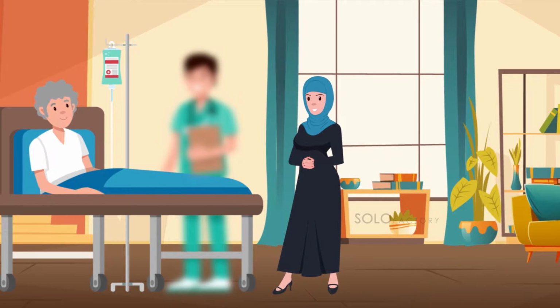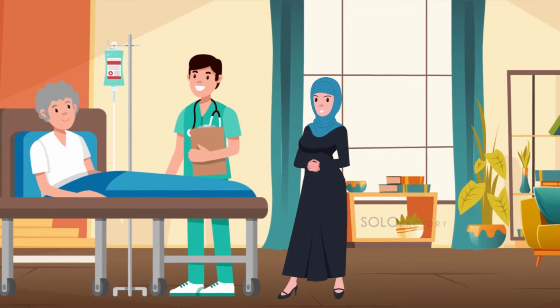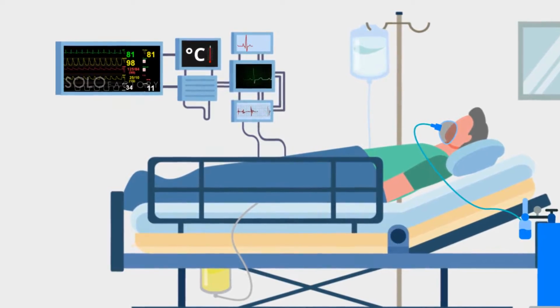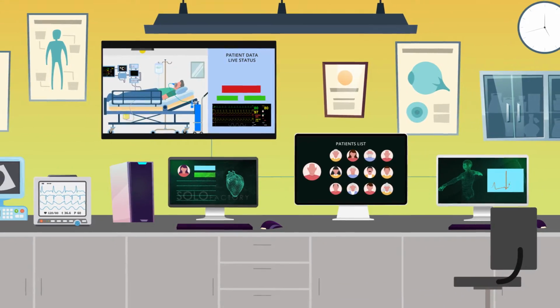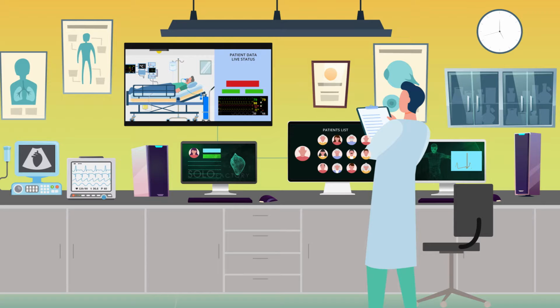manual checkup and educational training for the patient's family members about the system and care plan. This system has two platforms, one for the healthcare provider and the other for the patient's relative to monitor the patient. The healthcare provider's platform is a big monitoring room setup that they can access from their home care center 24/7. Multiple patients can also be monitored using this system.